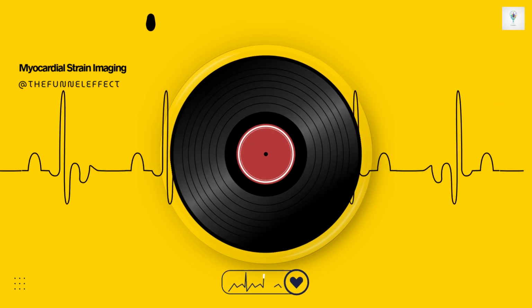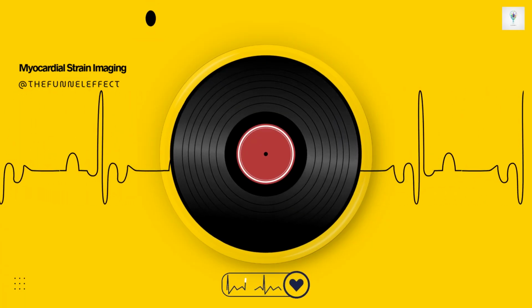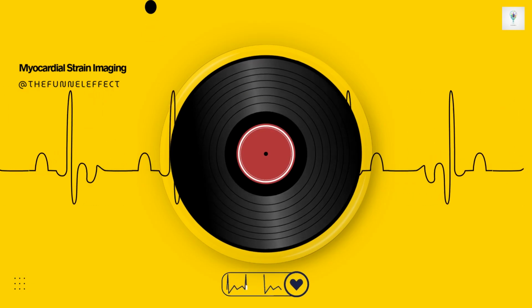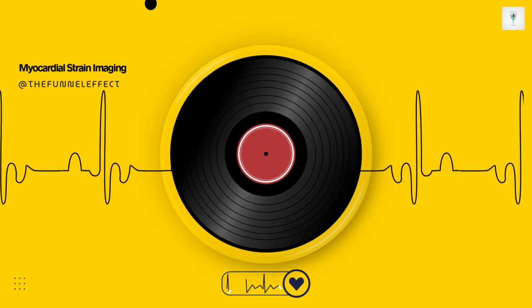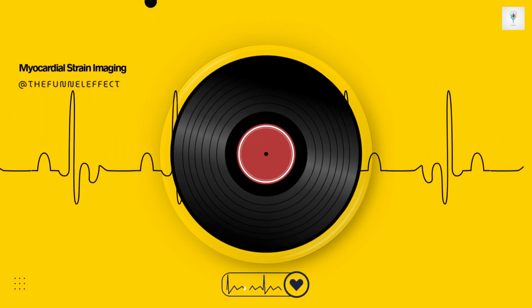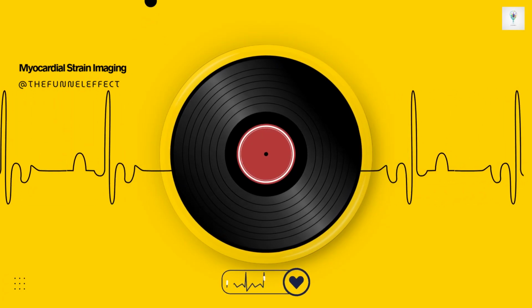And these speckles move with the muscle. Yes, they're intrinsic to the tissue image. Since they move with the tissue, tracking them frame by frame in 2 dimensions allows the software to calculate deformation in multiple directions simultaneously without being dependent on the angle of the ultrasound beam.